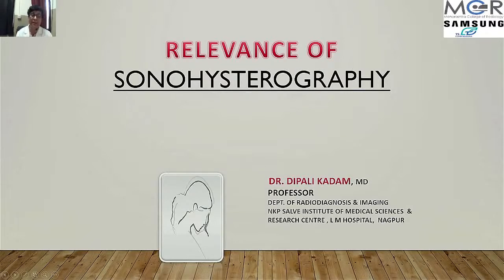So just imagine a lady who has walked into your clinic with a complaint of postmenopausal bleeding, is hypertensive and taking tamoxifen for CA breast, and she is referred for pelvic sonography. You do a sonography and you find that she has a thickened endometrium.